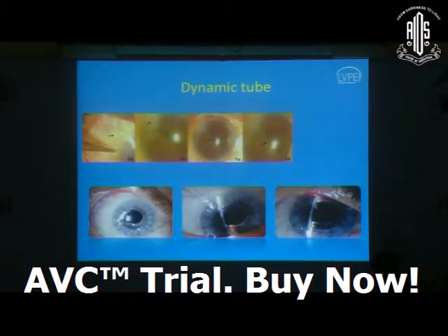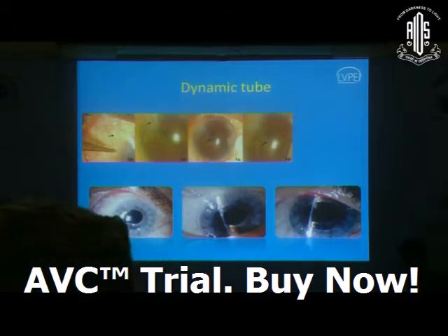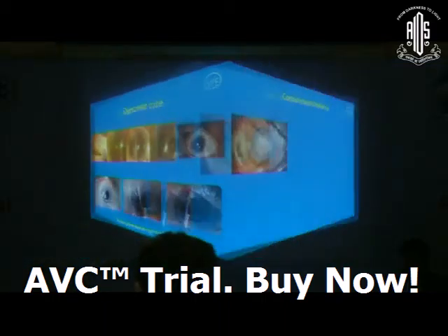This is a very interesting complication that I noted. One of the patients was referred with a dynamic tube. That means the tube goes into the subconjunctival space, and as the patient looks straight or down, in extreme down gaze, you can see the tube becoming longer and getting retracted into the subconjunctival space. By doing so, the patient actually had a block of the tube. So we had to explant it and redo the procedure in this patient.